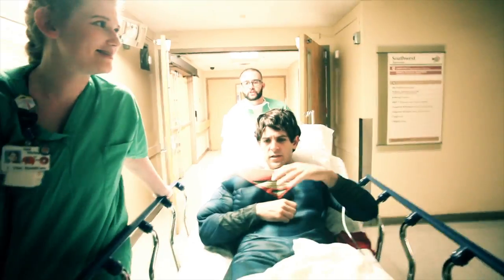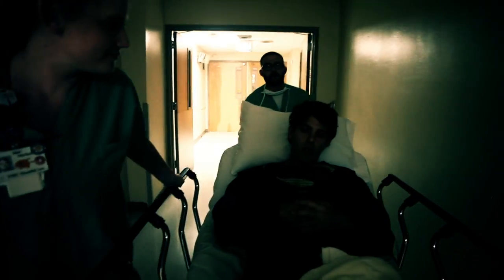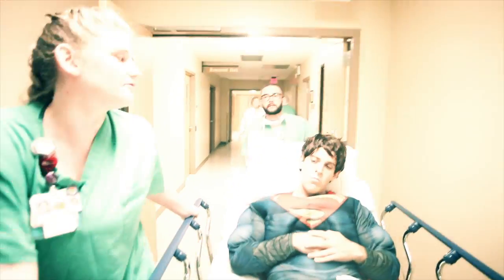I don't need this, I can breathe in space! Sir, you're having a heart attack. We're going to do an angiogram through your wrist. I thought you normally did that through the groin. We used to, but now we can go through your wrist. There's less complication of bleeding, shorter bed rest, and more comfortable for you.